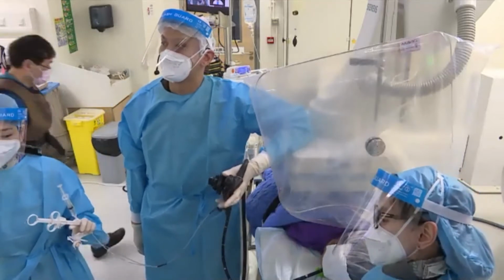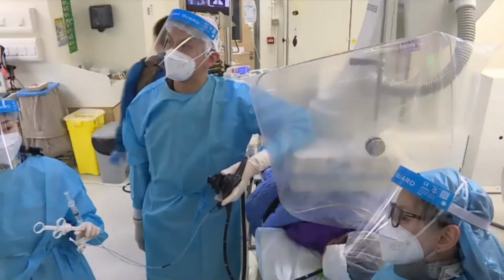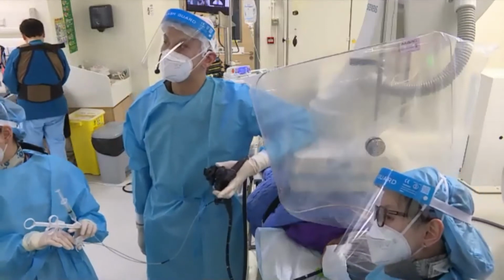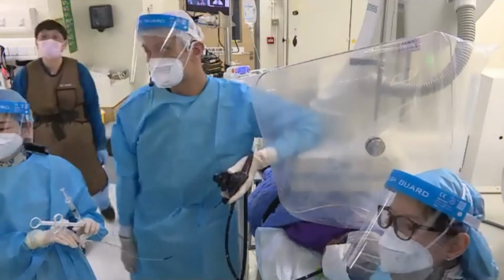With the current costs that are there, I don't think they'll be in routine use, and I think it's very difficult to justify the use unless the costs come down to, as Shyam's paper showed, less than $600 or something. Then maybe there's justification. Otherwise, there's no justification.